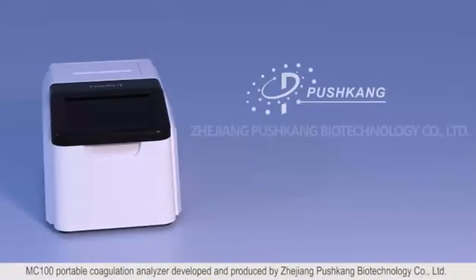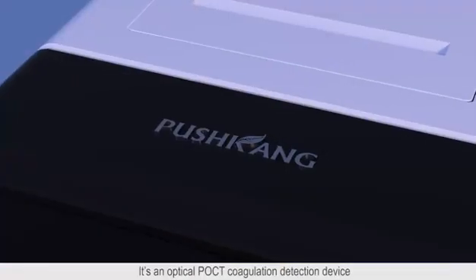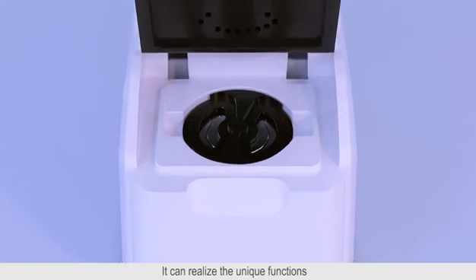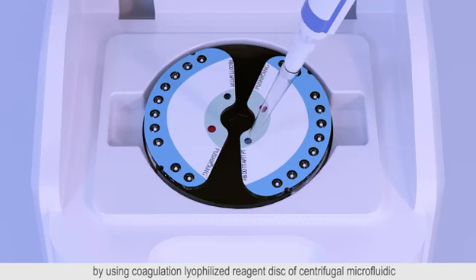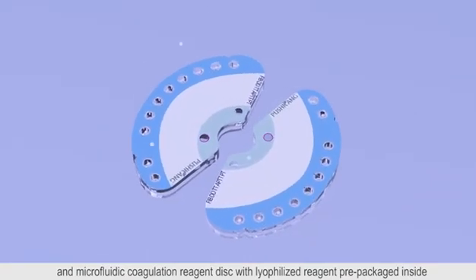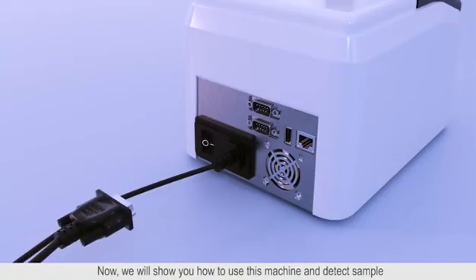MC-100 Portable Coagulation Analyzer, developed and produced by Zhejiang Pushkan Biotechnology Company Limited. It is an optical POCT coagulation detection device based on centrifugal microfluidic technology platform. It can realize the unique functions of whole blood on the machine, centrifugation in the machine, quantitative distribution and plasma reaction by using coagulation lyophilized reagent disk of centrifugal microfluidic. The MC-100 system includes the MC-100 Coagulation Analyzer and microfluidic coagulation reagent disk with lyophilized reagent pre-packaged inside. Now we'll show you how to use this machine and detect sample.